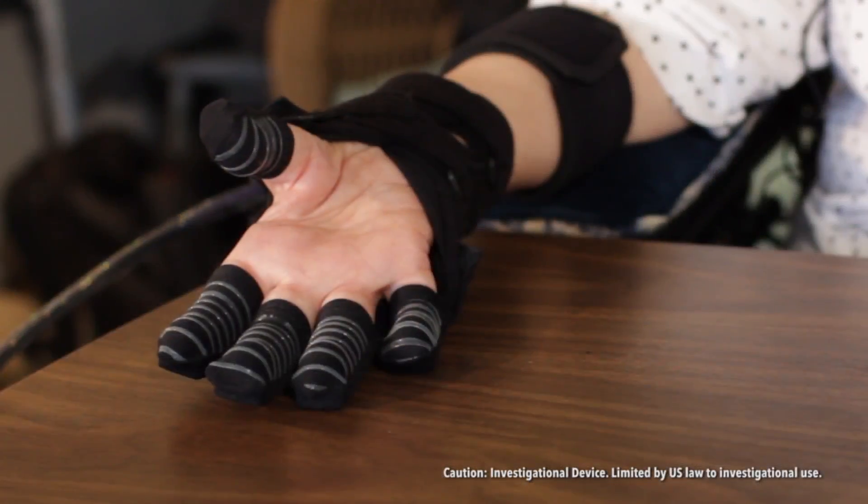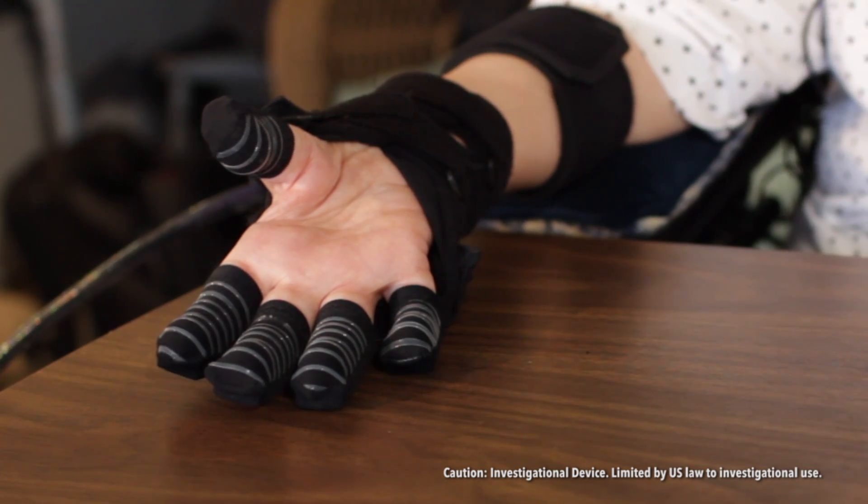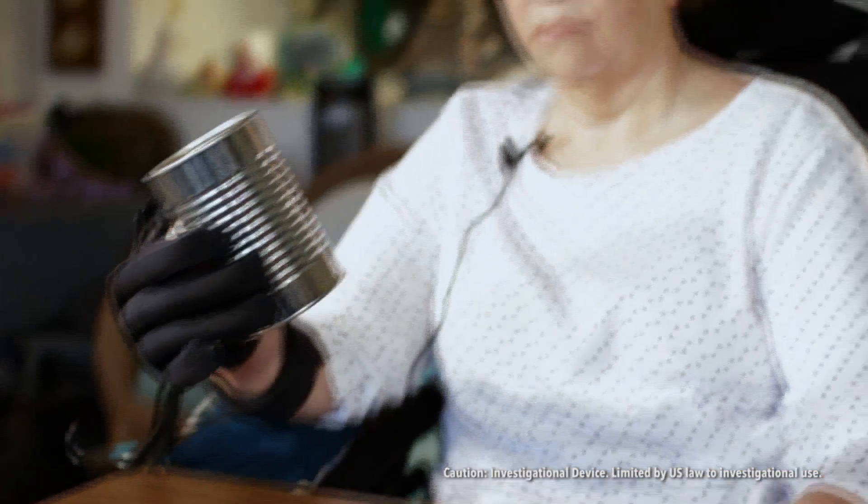I think it's wonderful. It's really comfortable. It feels good to have it on. It feels nice to have my fingers extended, but most of all, it's the function — to have strength in my hand again. It's just wonderful to be able to firmly grasp something and not feel like I'm going to drop it.